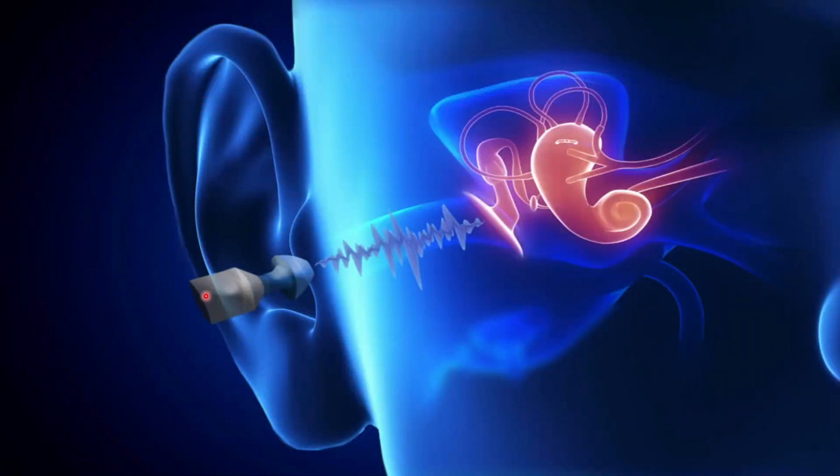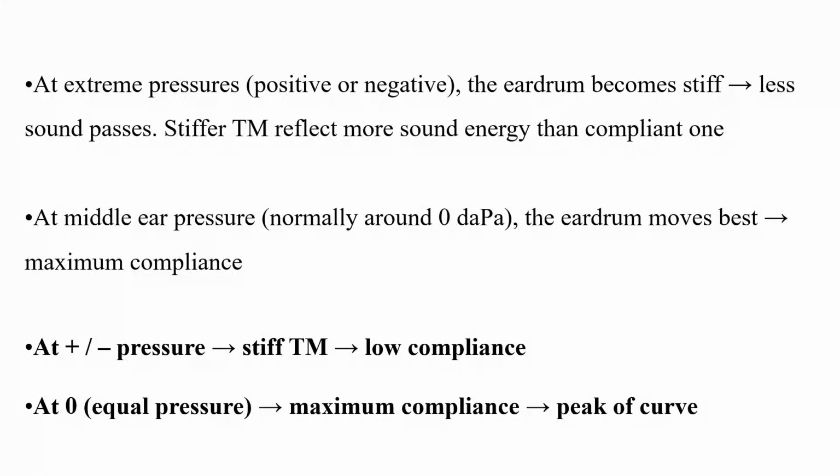So this again is a rough diagrammatic representation of how the probe tone goes and strikes the eardrum, and the things I have explained will go on further.